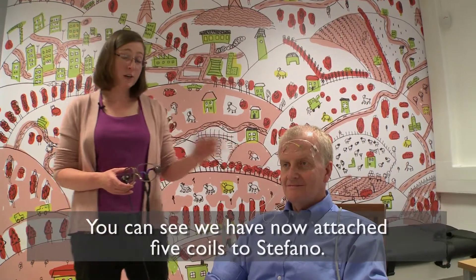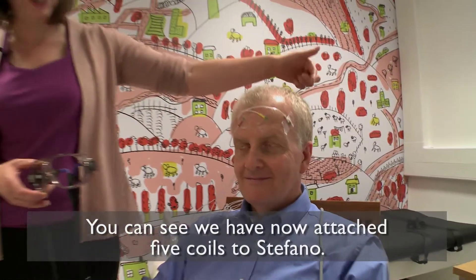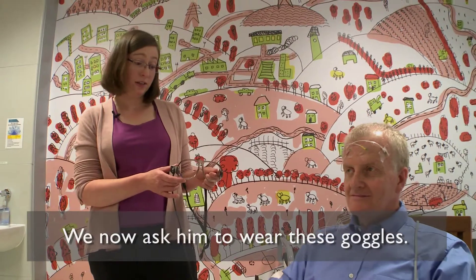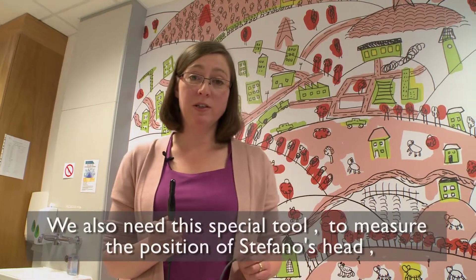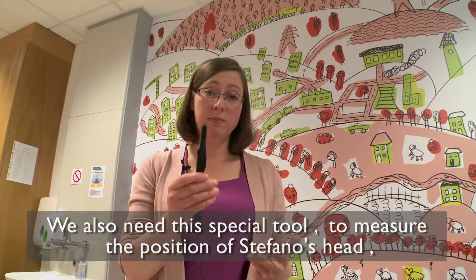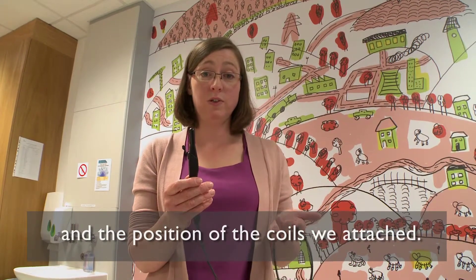We've now attached the five coils to Stefano — three on his forehead and one behind each ear. The next step is to ask Stefano to wear these goggles. The goggles are an important part of the next step, and we also need this special tool that we use to measure the position of Stefano's head and the position of all those little coils that we've just stuck on.